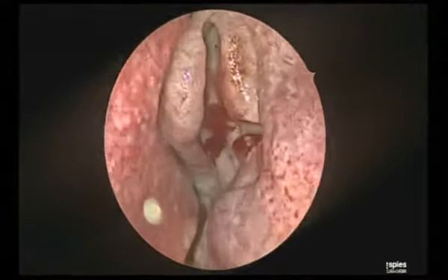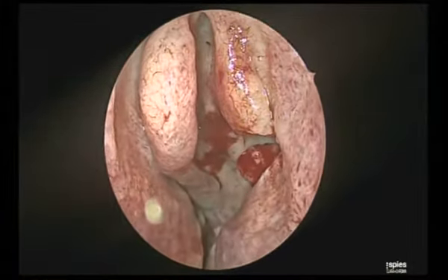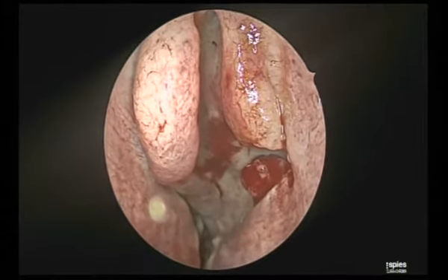See now, another important thing: every time after every step, I make sure to mop with the Merocel. I call it a magic Merocel.